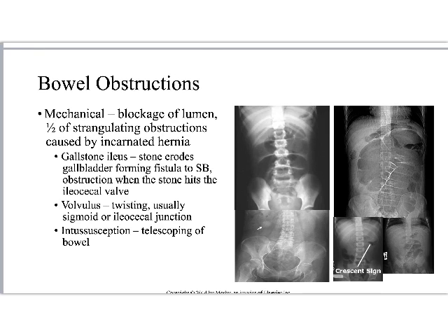The important thing here is all of the air. Because what they like to ask a test question about this, because it's so counterintuitive, that if the bowel is obstructed, it's full of air, I need to decrease my radiographic technique. That's why they like to ask questions about it. Because it's counterintuitive and it's also common. We see a lot of it and it requires a reduced technique. It's counterintuitive though.